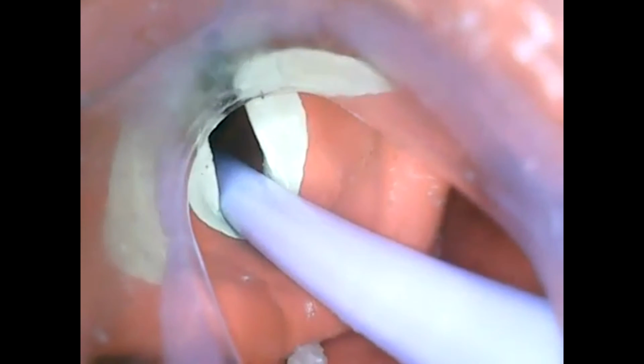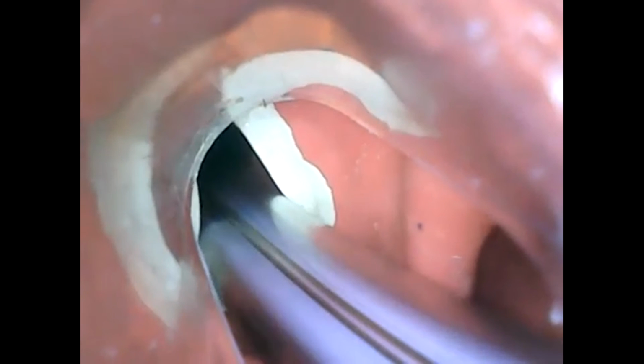Select the proper endotracheal tube for my patient, and then here it is, back out, then back through. I've just watched it go through the cords. Now I'm going to remove my bougie, see that it's still in place, remove my scope, and that's it. So that's how you can use the V-scope to watch the endotracheal tube pass the vocal cords each and every time. Thanks again for your questions.